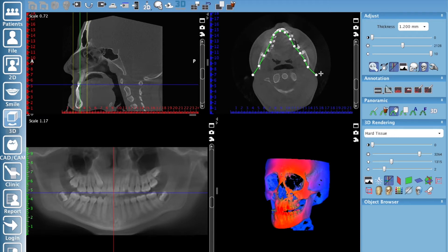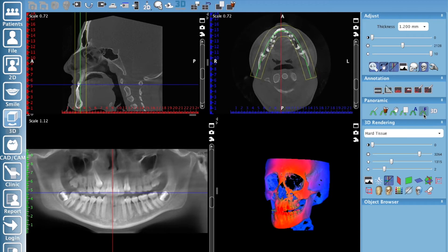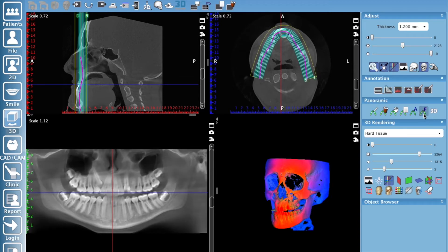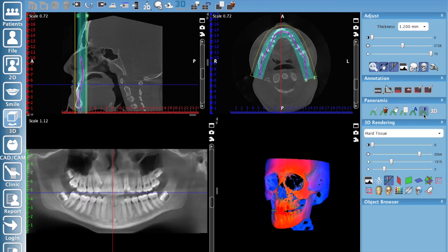Another way, which is my preferred method, is the arch icon with an 'A' — it's for auto fit. If you click this, the software will automatically create a panoramic curve that it thinks is ideal. That's a fantastic way to get a good panoramic image with one button click. Then the arch with the 'F' is to auto focus it. Click that, take a look and see if it's better or worse — you can turn it off if you don't like it.